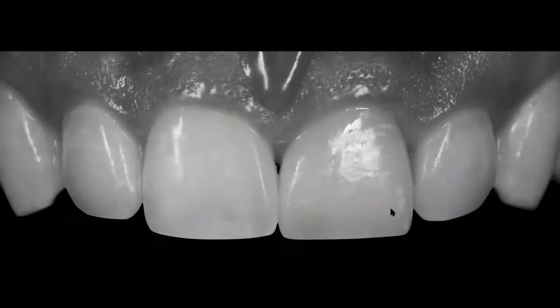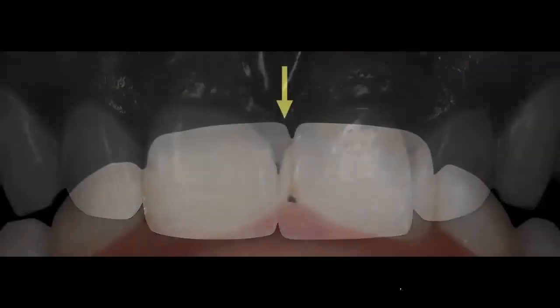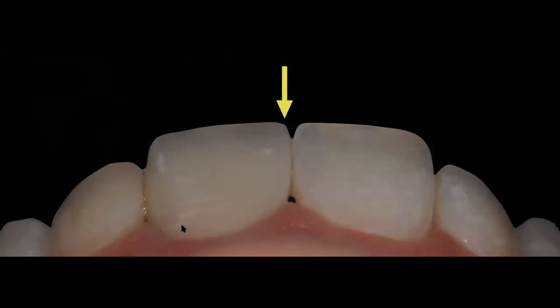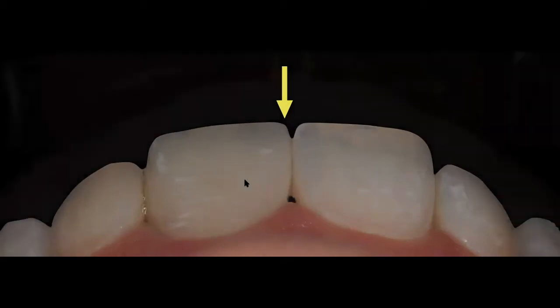So I was not going to send this case back to the same lab, because I was not happy with a lot of things in this restoration. Now I want you to look at this, look at the mesial line angle. The staining was very unnatural, because I did want a little bit of white spots since the patient had them on his natural teeth, but this is not natural. The texture wasn't natural either. So again, I was really not happy with the final result. Again, the lack of that mesial line angle.